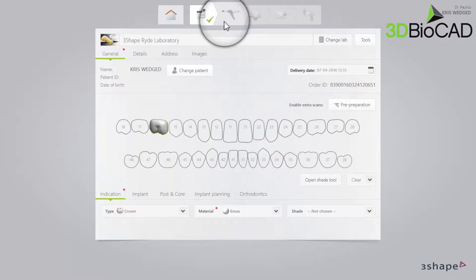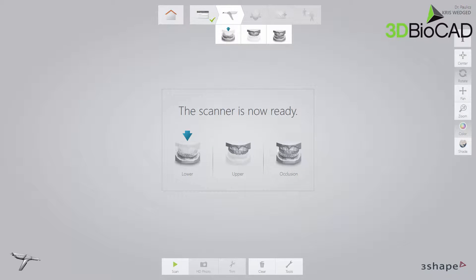Now proceed to the Scan page. Use Retraction Cord and/or Hemostatic Agent if parts of the margin are subgingival. In this case, start by scanning the opposing arch to allow time for the retraction methods to take effect. As the preparation is on the upper arch in this particular case, start by scanning the lower arch.